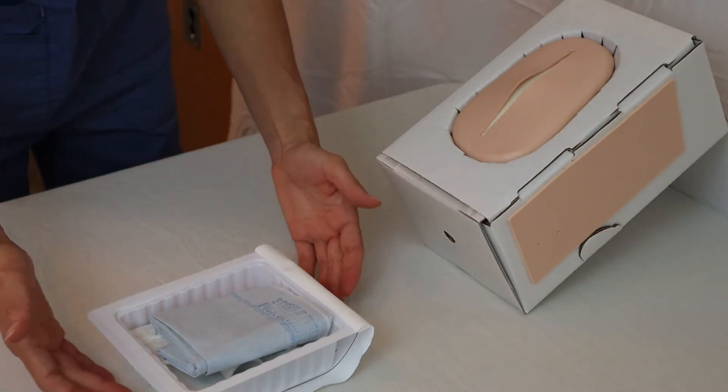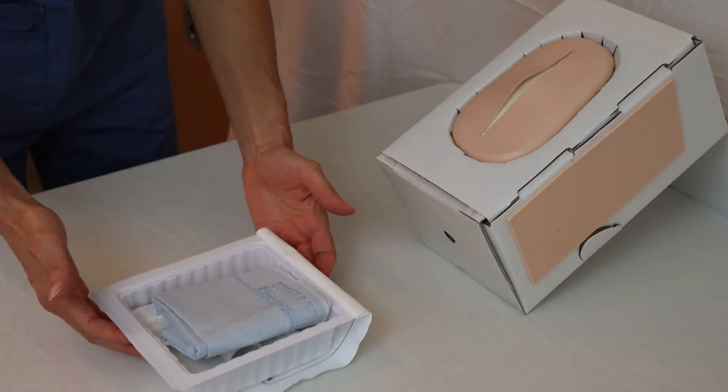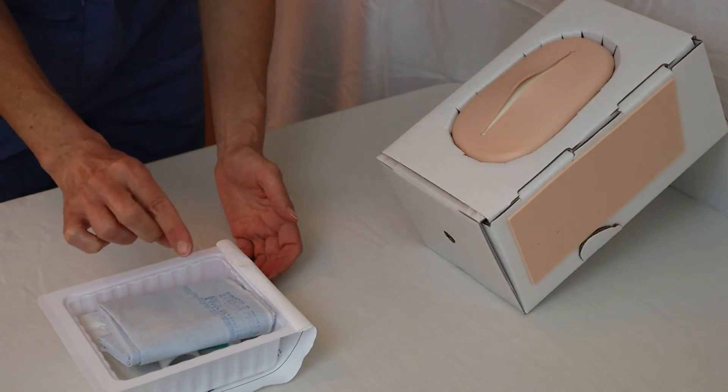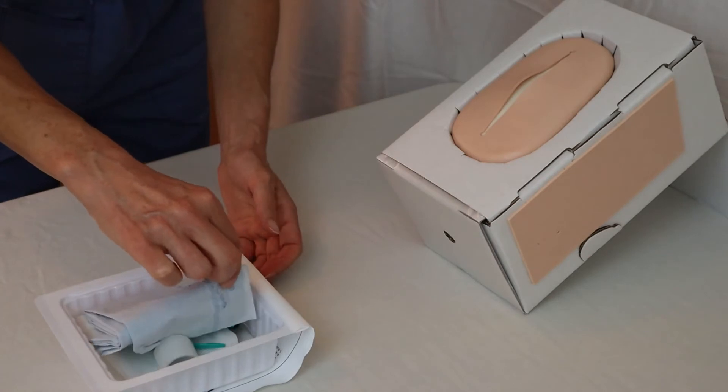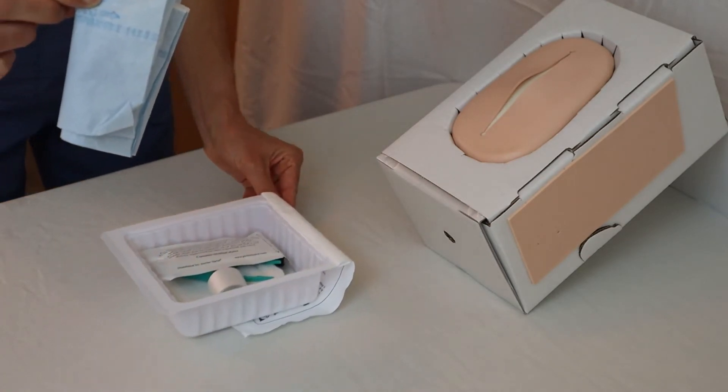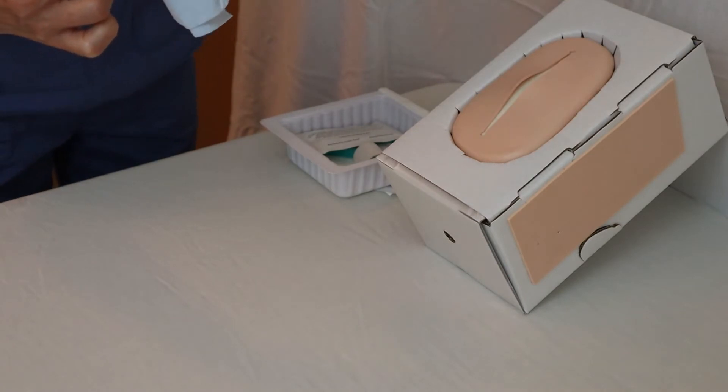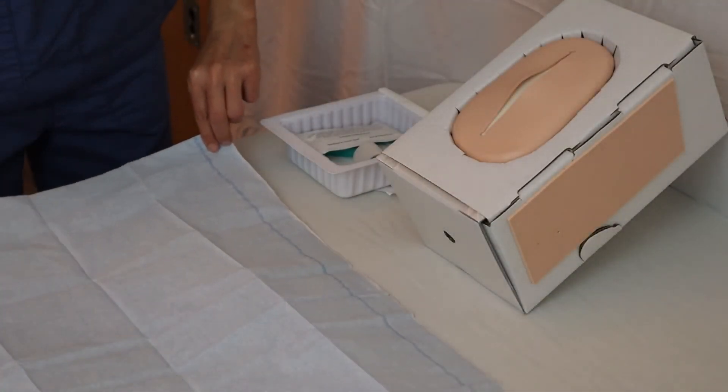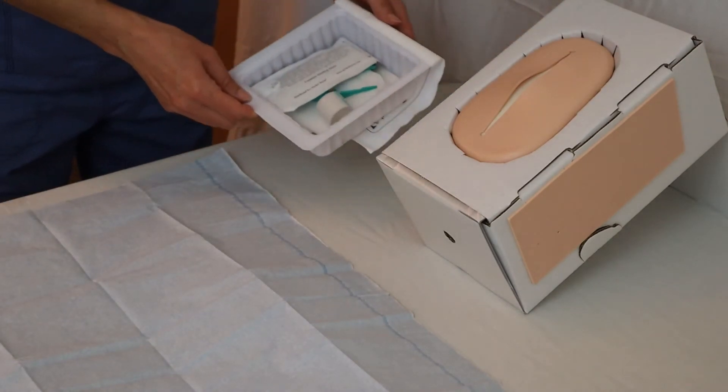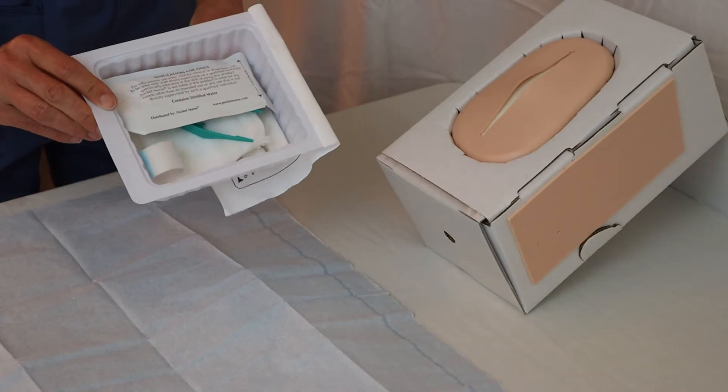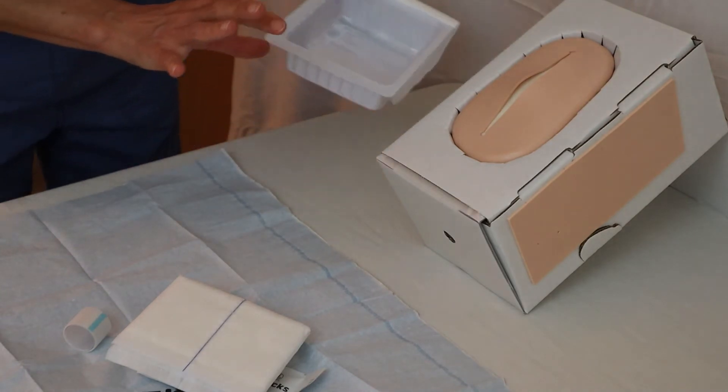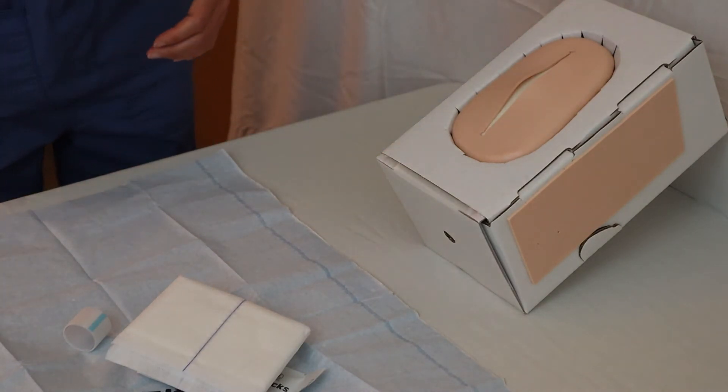Everything in here is sterile, so now I have to be careful. I'm going to pick up one inch of the edge of that drape, pick it up right here, move the remainder of the box out of the way, hold it at the edge, let it unfold, and then set it up. Now I have a nice sterile field and I can take the contents of the sterile dressing kit and just dump it on here, being careful that they don't roll out to this one inch margin.